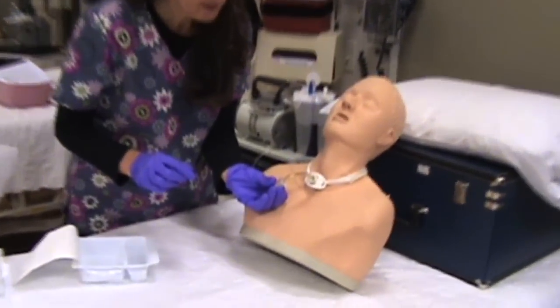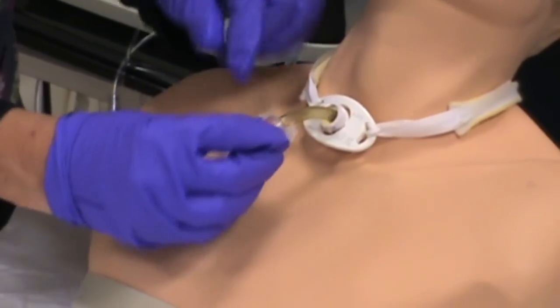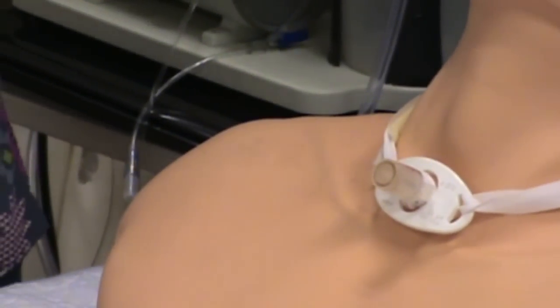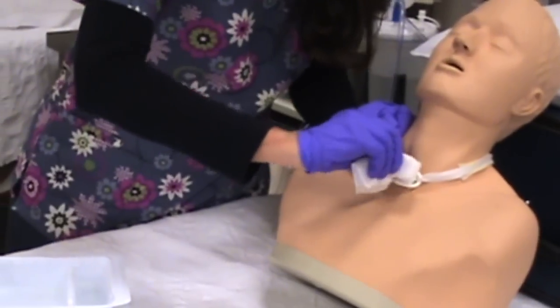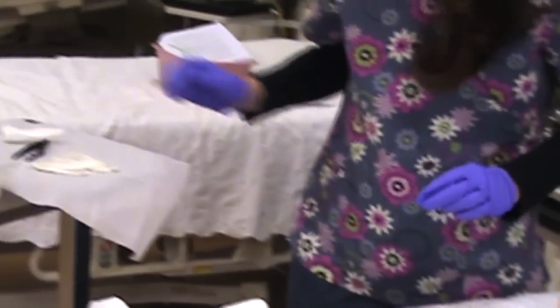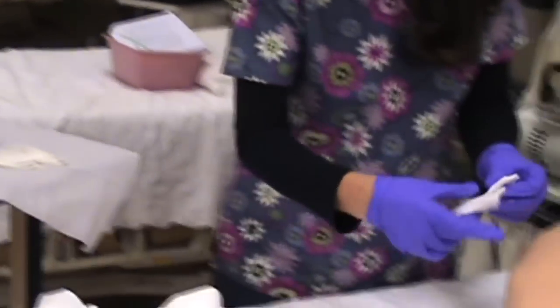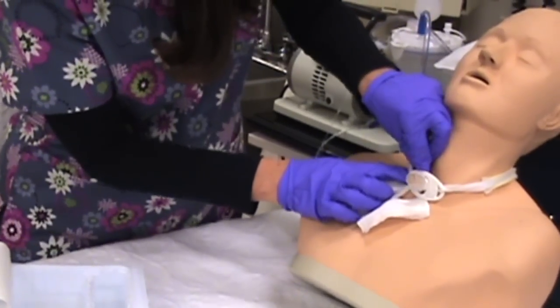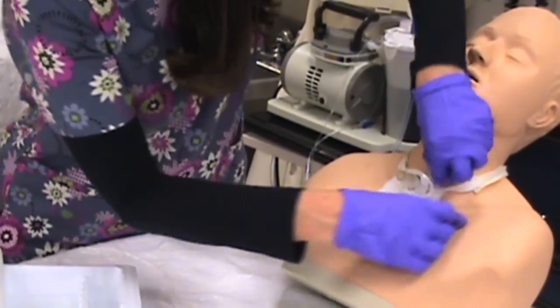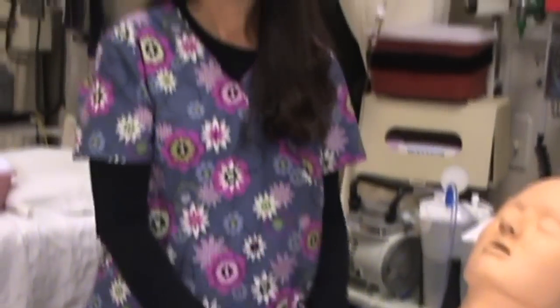At this point you can take it and put it back. I'm changing hands right now because I've finished cleaning it — I just need my dominant hand to help. I'll use this final one right here to just clean this off. Now it's back in and it's working. I don't need any of this stuff anymore, so I'm going to take the drain sponge and place it on one side of the patient and then the other side. It's been sufficiently cleaned. Hopefully you learned how to do it. Thank you.